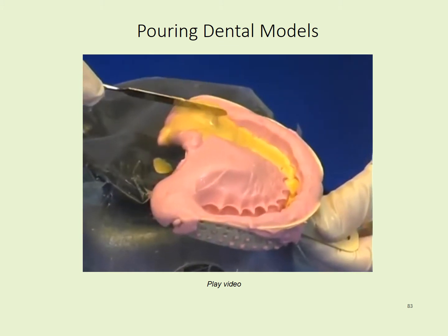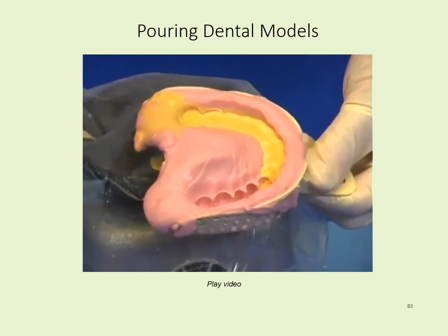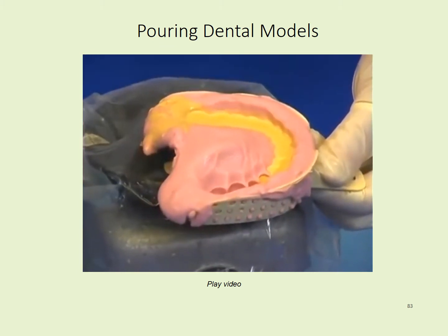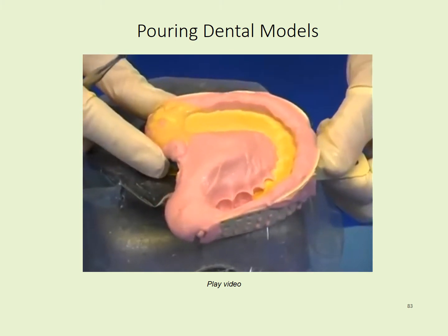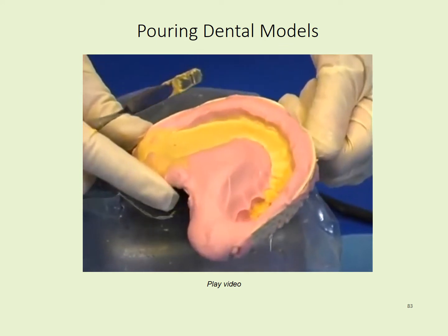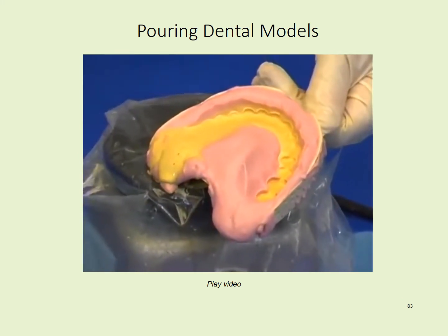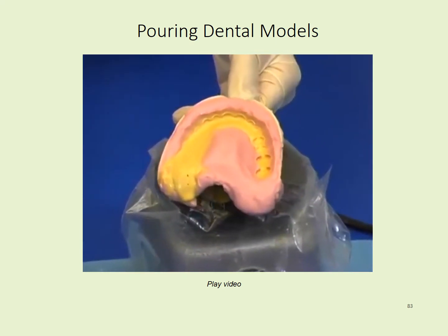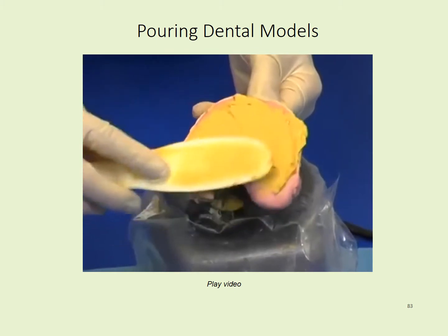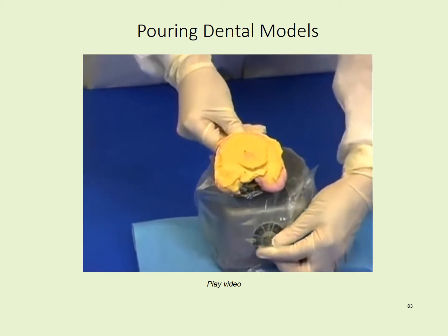Continue adding small increments of stone to the most posterior end of the tray, allowing it to flow anteriorly. Air bubbles will form if the mixture flows too quickly over the tooth indentations. Tilt the impression toward the opposite posterior end and continue adding stone until the flow reaches the other end of the impression. When all the tooth indentations are filled with stone, lift off the vibrator and begin adding larger amounts of stone until the impression is filled to the top. Vibrate the entire tray for 2 to 3 seconds to settle the material.